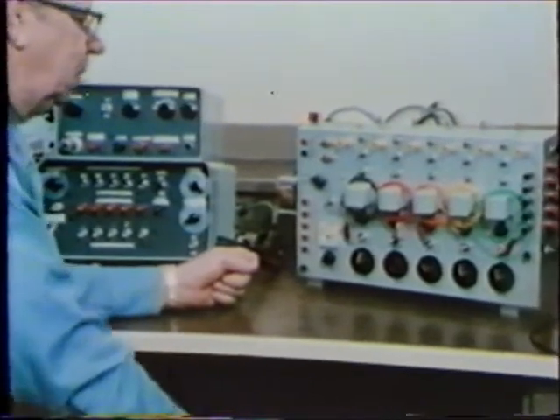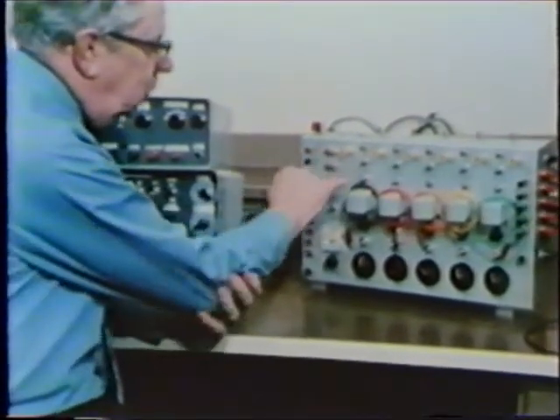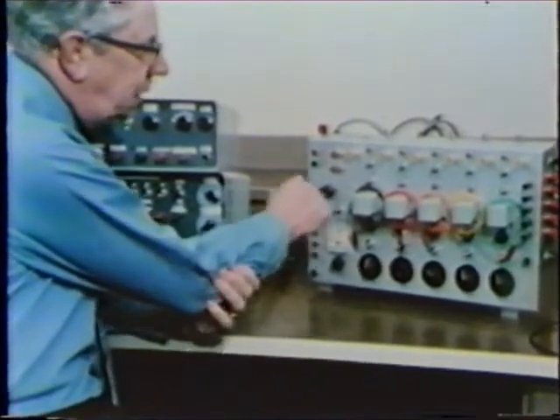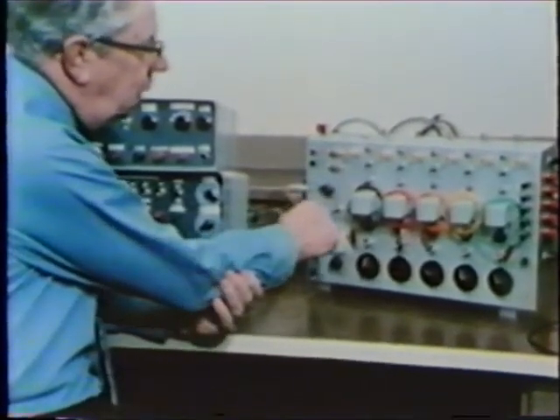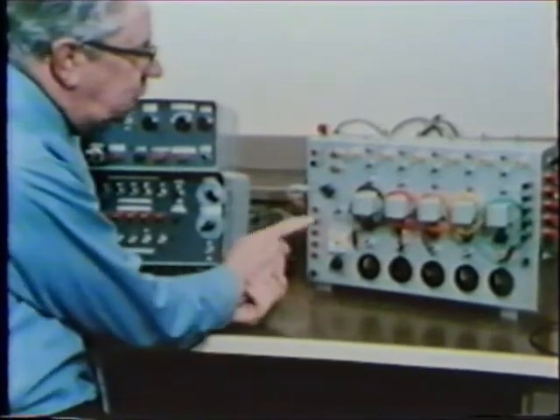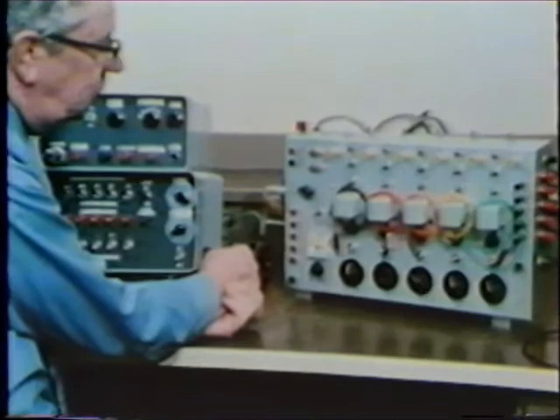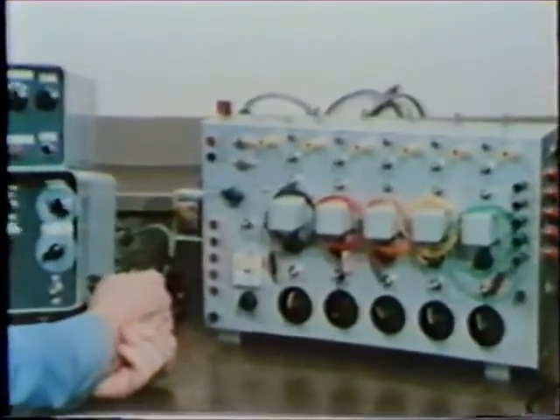signals. We felt that we needed greater flexibility to put different parts of the speech signals into different parts of the inner ear. This, after all, is the way the normal ear analyzes sound, the high frequencies being heard at the round window and the low frequencies at the apex of the cochlea.